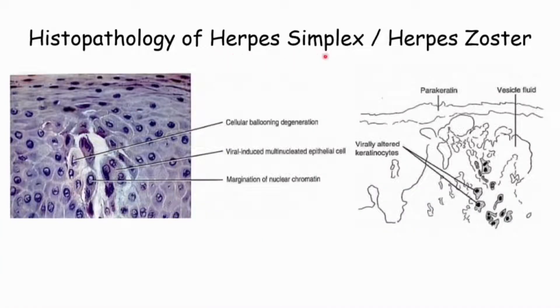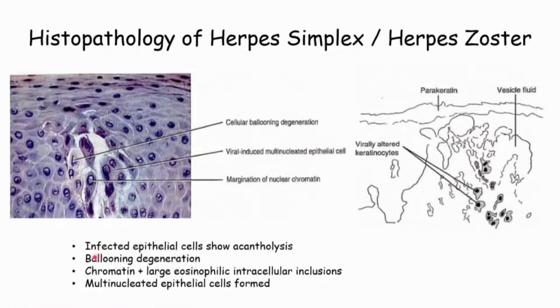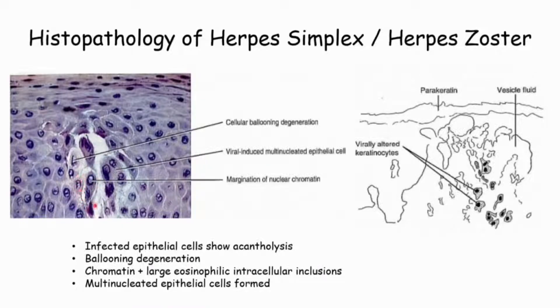Histopathology of Herpes Simplex Virus. The infected epithelial cells exhibit acantholysis, nuclear clearing, and nuclear degeneration, which is termed ballooning degeneration. There is also condensation of chromatin around the periphery of the nucleus, forming margination of nuclear chromatin.